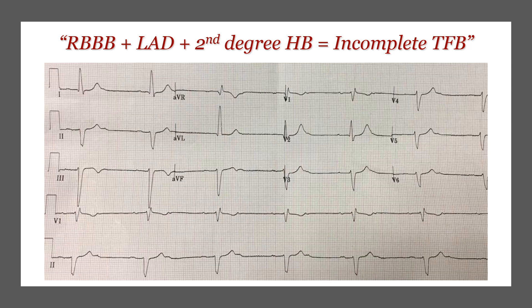Here is another example. We have an RSR' pattern with a broad complex — right bundle branch block. The axis shows lead one pointing up and AVF pointing down — left axis deviation. Looking at V1, we see: P, P, then a complex; P, P, then a complex. They map nicely — that is a second degree heart block. In summary, this is another incomplete trifascicular block.